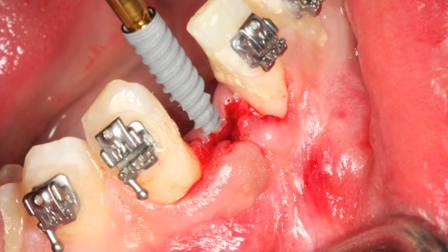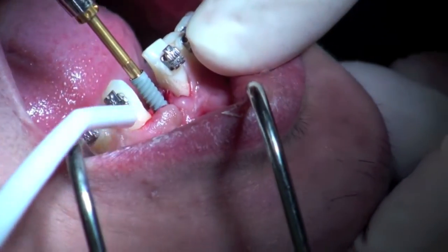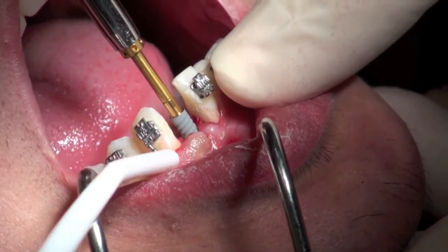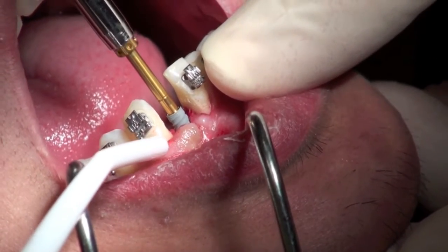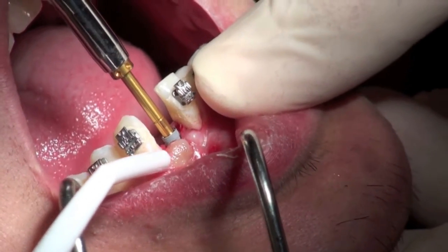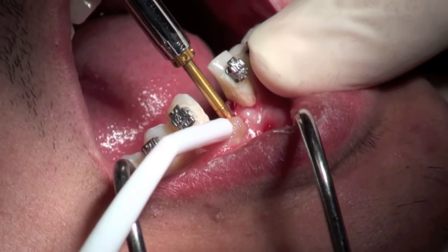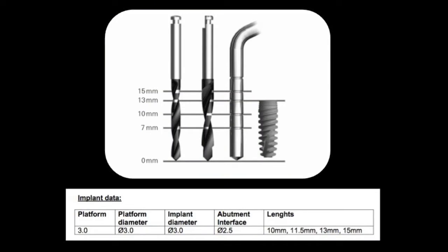I'm using the driver to carry this to the mouth, which is the recommended way to do this, because I can really focus on angulation and try to see down the overhead of the implant and keep an eye on where this implant is actually going. The aggressive thread enabled me to actually get a nice high torque on this implant, and therefore I'm able to do an immediate temporary on the day of delivery of the implant, and then wait three months and then put on a final restoration.